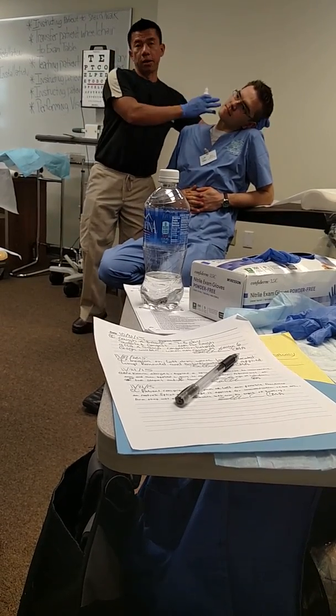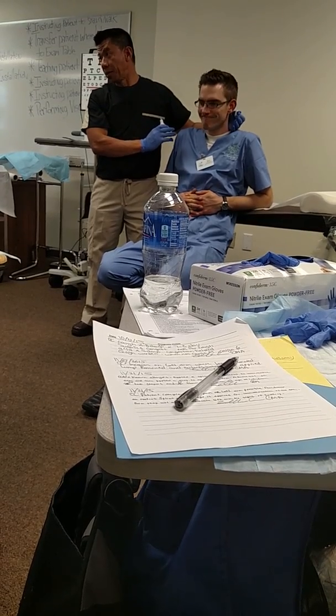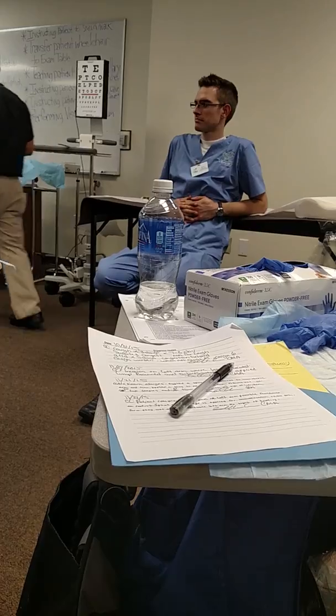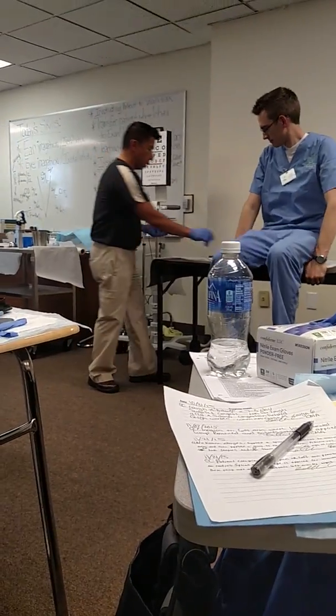Because if the patient what? Leans back, it will what? Just obviously drain the medications out of the ear. So after a few minutes, the doctor normally, with the first order, will instruct the medical assistant to perform the irrigation.